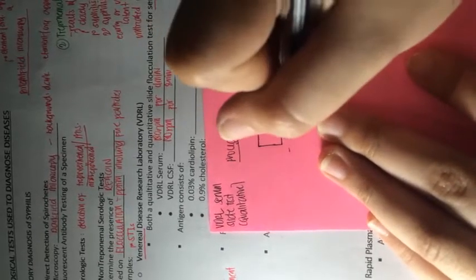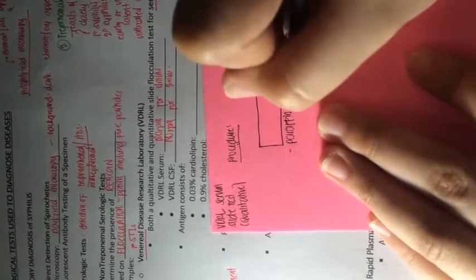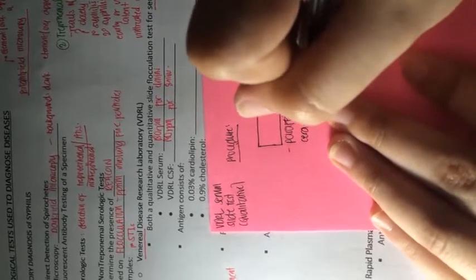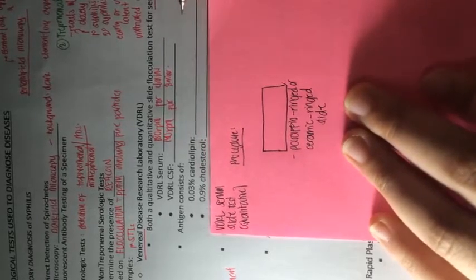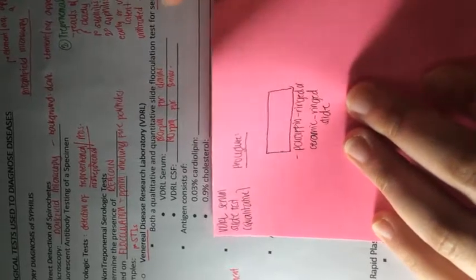Just imagine that this is a slide. The slide should be paraffin ringed or ceramic ringed. We cannot just use any slide, but I think in the laboratory we use any slide available.